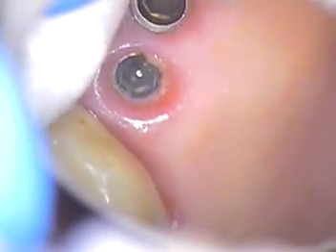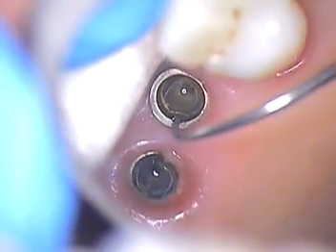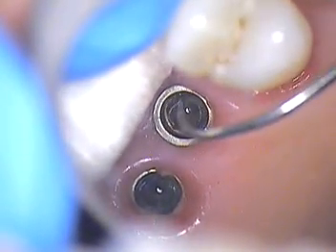Hello, this is Dr. Jerry Cuomo. I'm back with this double abutment case that we have. There are internal connections here on both. We had to go with a solvent that we use every day on dentures.